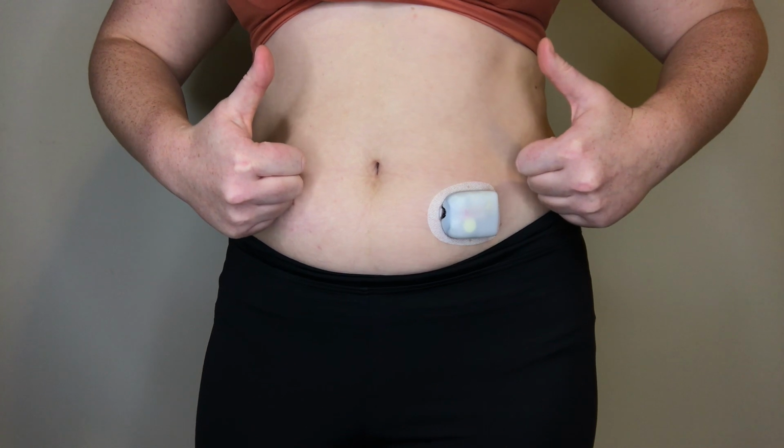Now that the new pod is actually on, I highly recommend not getting it wet for at least a few hours. Now the pods are waterproof. However, if you jump in the shower right after changing it, it will peel right off. Don't know why a couple hours does the trick of it actually sticking, but trust me, it does.